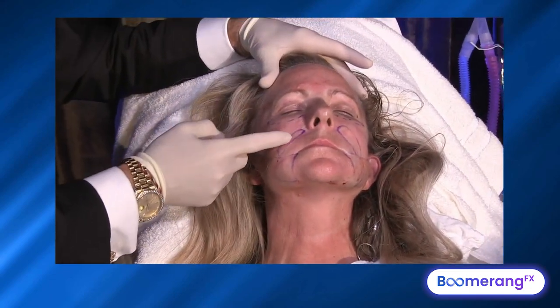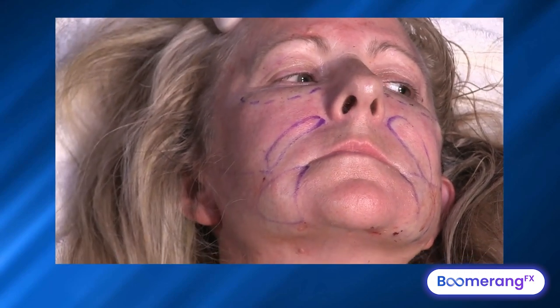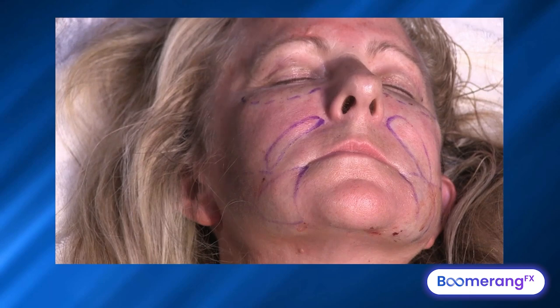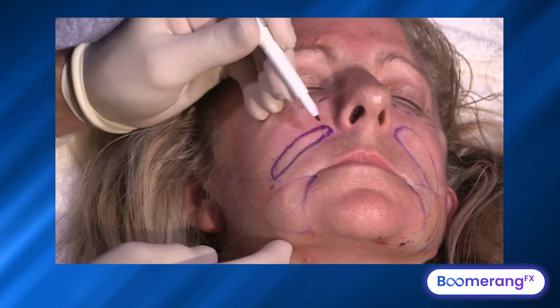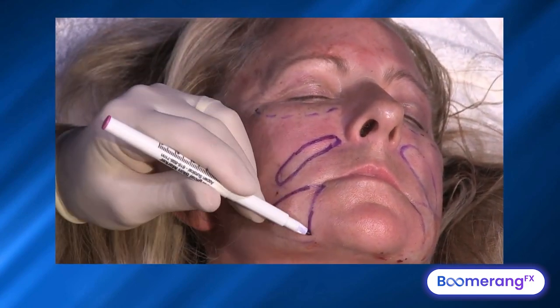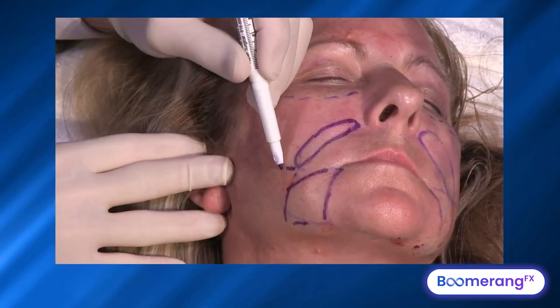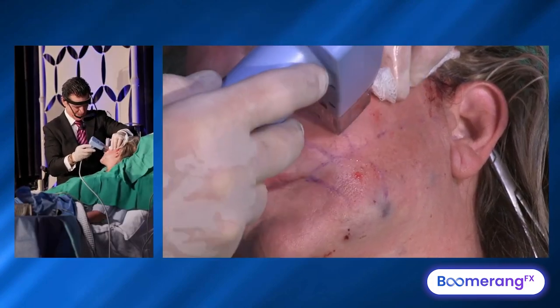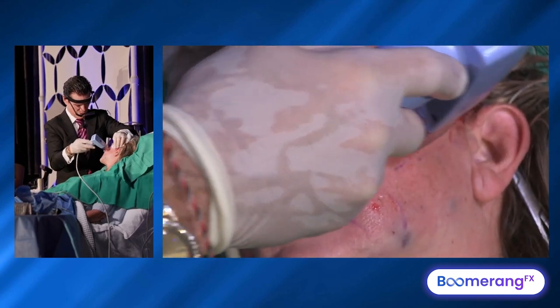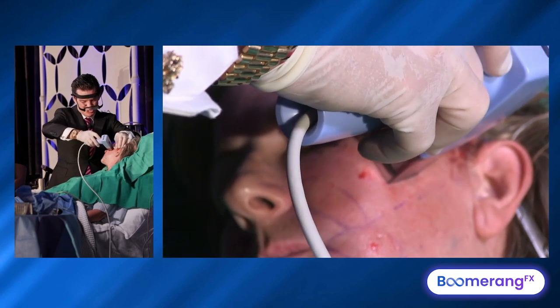Make sure you get good pre and post photos. Looking at her markings, you can see I marked out her nasolabial fold, her labial mental fold, and jowl. We are going to go after these areas fairly aggressively because they are what bother her. I'll show the Accutite and the FaceTite, since everybody has a little different goal here today. We can go right up the buccal space here with this M8 body, creating a tremendous single-treatment RF fractional rejuvenation injury under the eye.